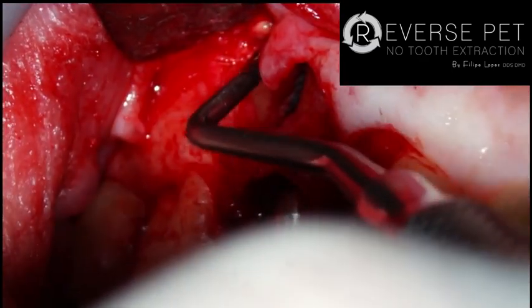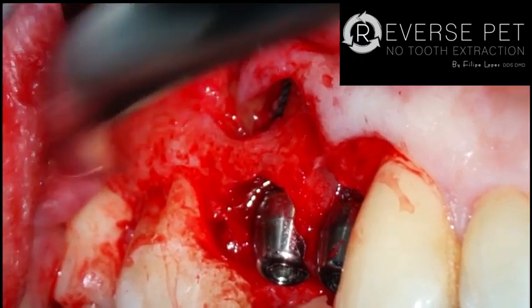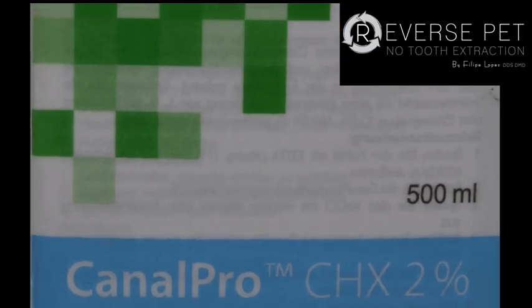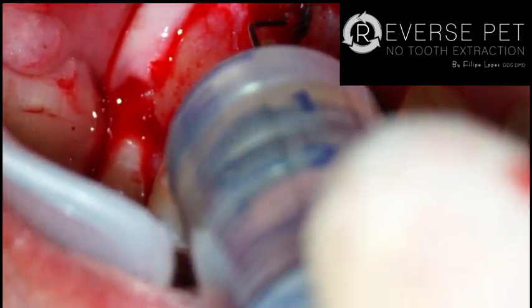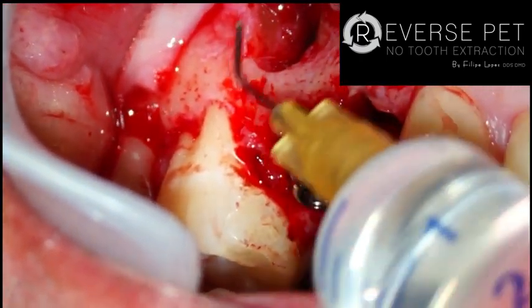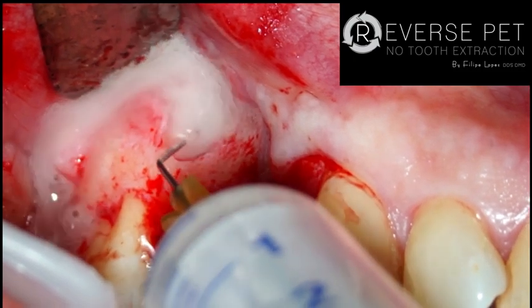So everything is removed. Okay, the inner part was already removed through the alveolus, always irrigating everything because it's an infected area. So always irrigating very well, thoroughly this region.